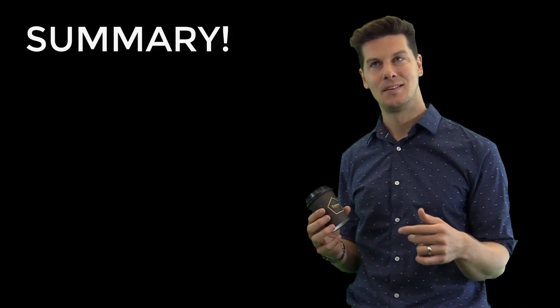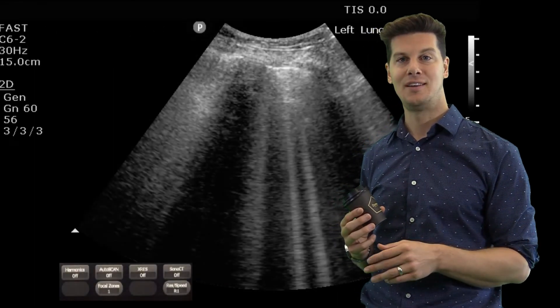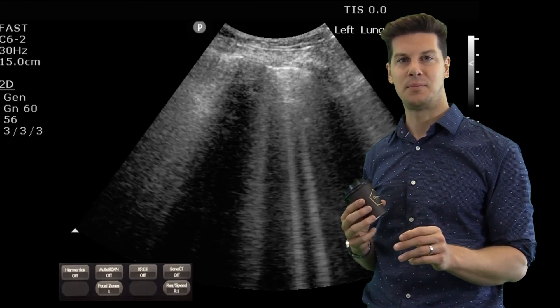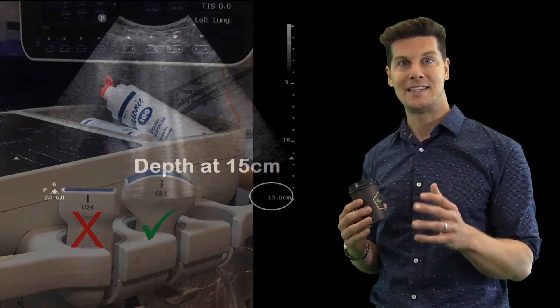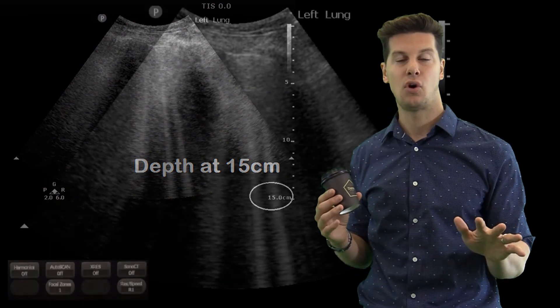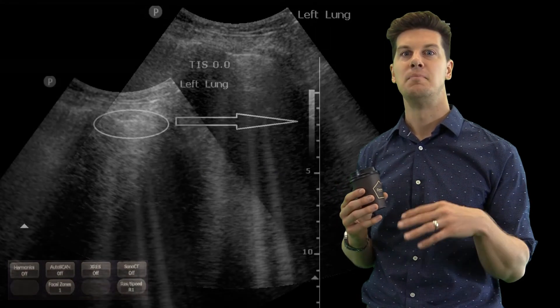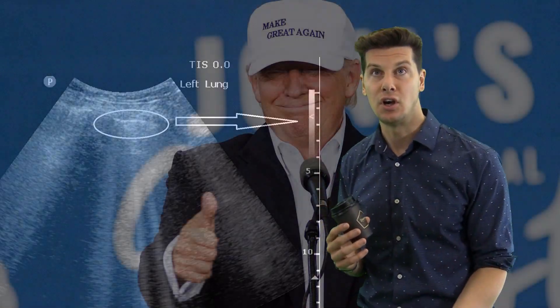Step five: finally, it can help to turn up the far gain. To summarize: B lines are visualizations of crepitation. They arise at the pleural line and extend much further than other lung artifacts. Select the curvilinear probe, set the depth to 15 centimeters, turn off those filters — useful for abdominal scanning but not for lung scanning — make sure your focal zone is at the pleural line, and turn up that far gain.